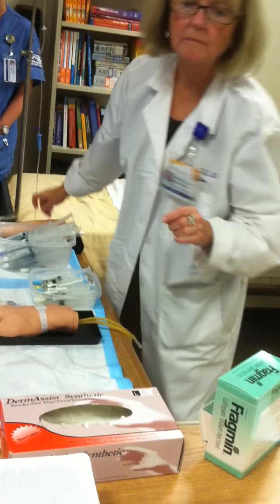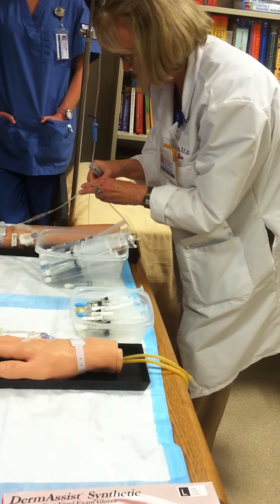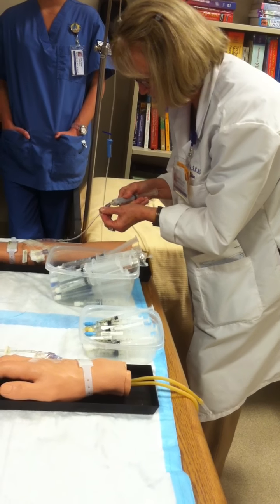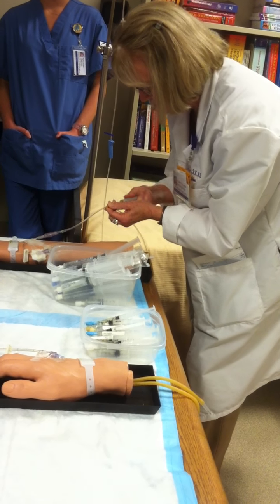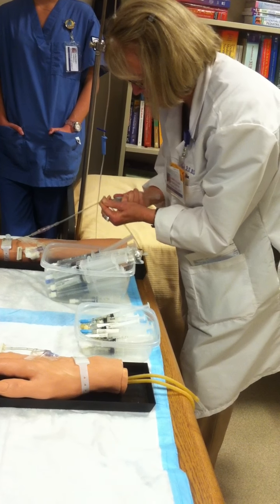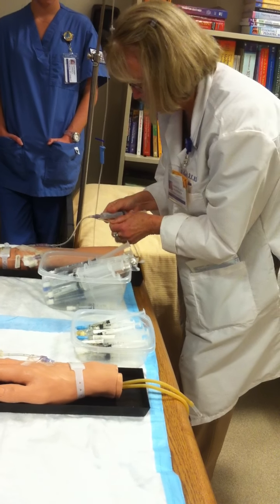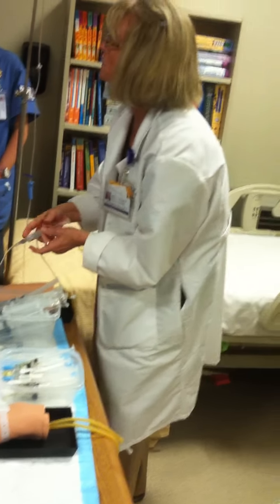Clean the port with an antimicrobial swab. Uncap the syringe. Steady the port with your non-dominant hand while inserting the syringe into the center of the port. Move your non-dominant hand to the section of IV tubing just above the injection port and fold the tubing between your fingers.